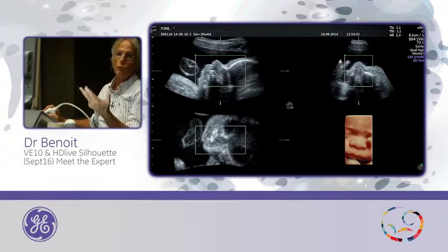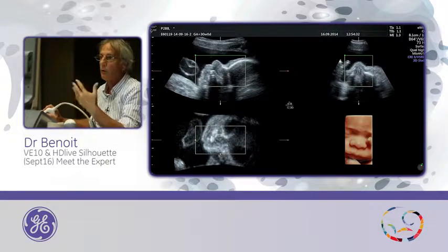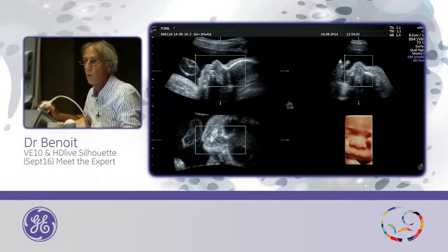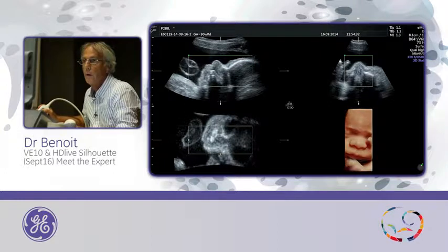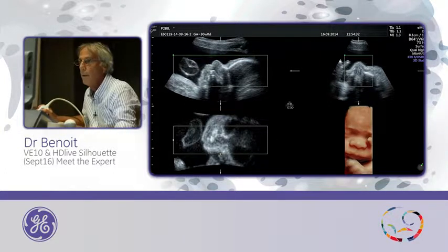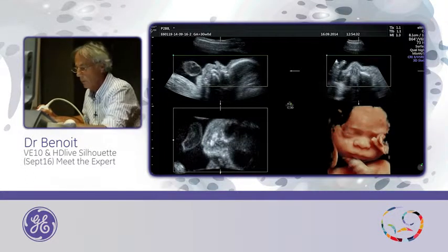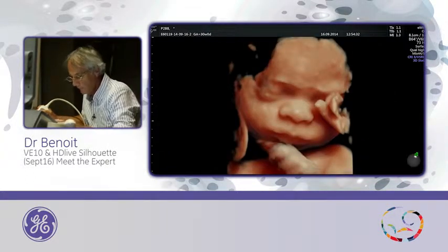And today, Roland is my foot switch. So this is the result. So if you don't use your two hands, you cannot obtain such a picture. Only if you are lucky, but you have to move the baby. Now we'll work with this picture. So increase the box on B plane.